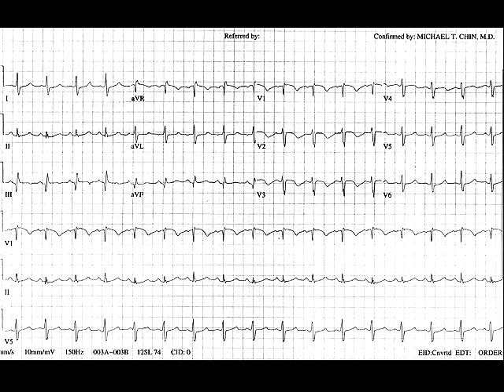Second, there is new rightward axis deviation and incomplete right bundle branch block. Third, there is now T-wave inversion noted across the precordium V1 to V4. The leads V1 to V4 overlie the anterior surface of the heart, which in this case is the right ventricle. These T-wave inversions and right axis deviation represent acute RV strain. This gentleman suffered a massive pulmonary embolism.